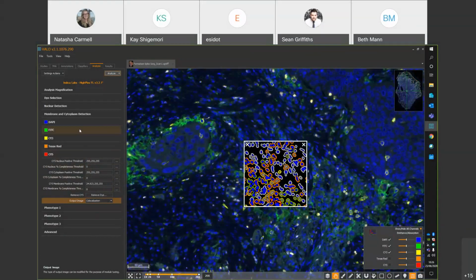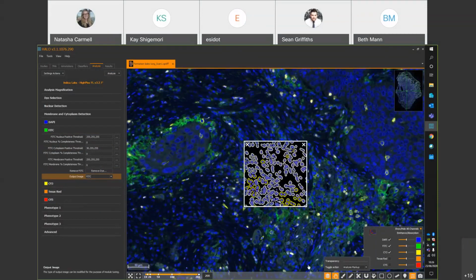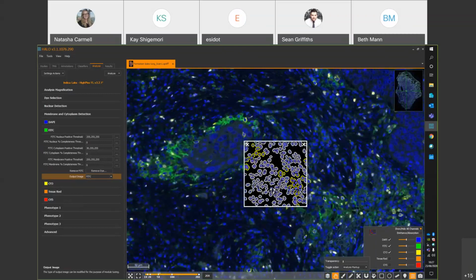So maybe we'll take a look at this with our FITC channel. So if we pop on just the FITC here, try and find some examples, can be tricky. Maybe if I bring the threshold down a little bit.